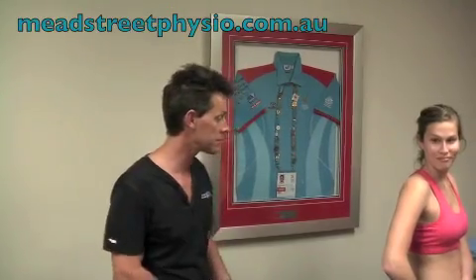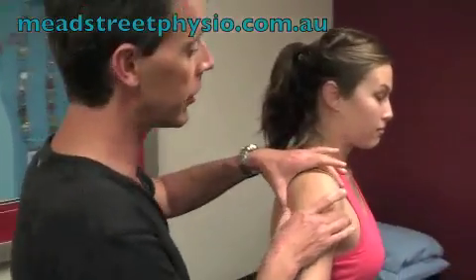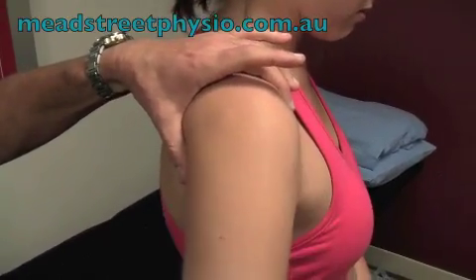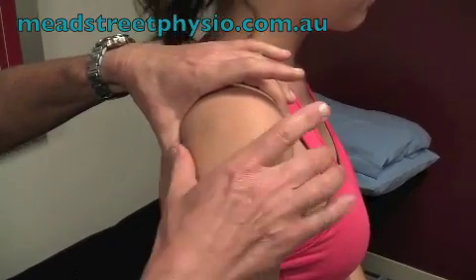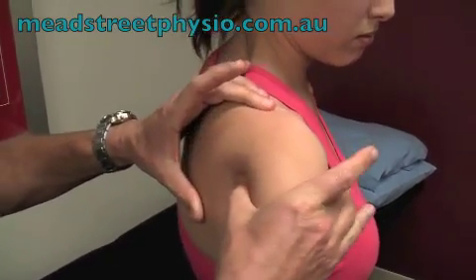We're going to go through some taping of the shoulder joint. And again, we've got Jess here with us to help us out as a model. With the shoulder, the taping that we're going to do is basically to help prevent the shoulder joint from moving forward, particularly with subluxing or dislocating shoulders. So the tape will essentially wrap across the front of the joint to stop it from moving forward.